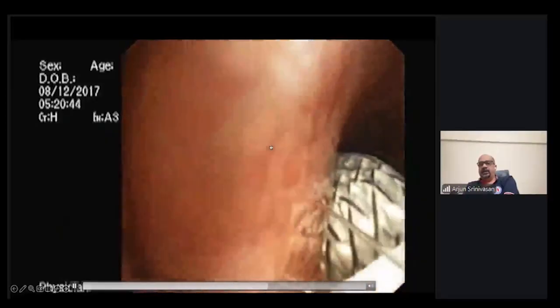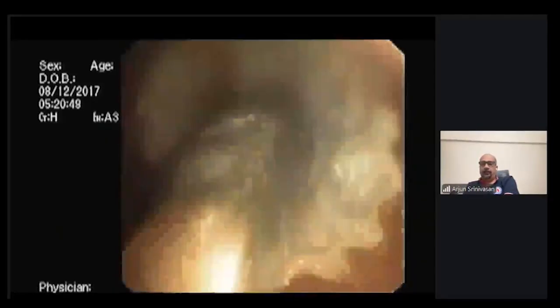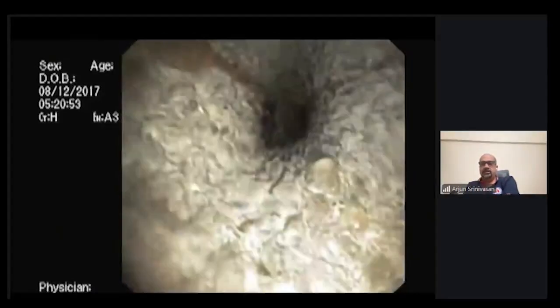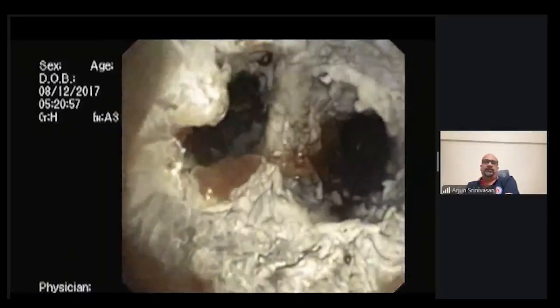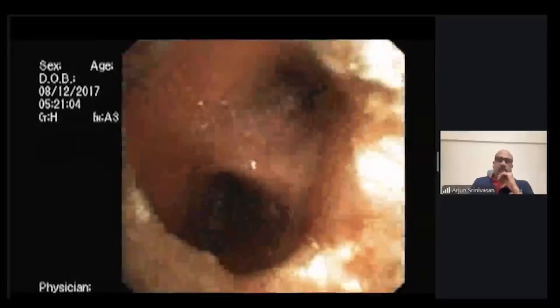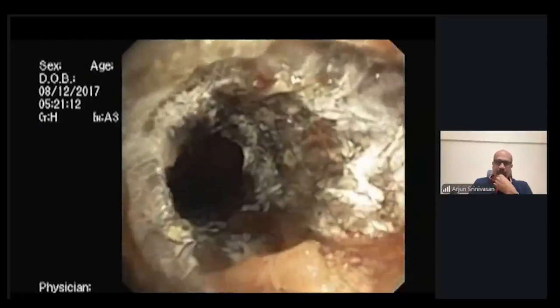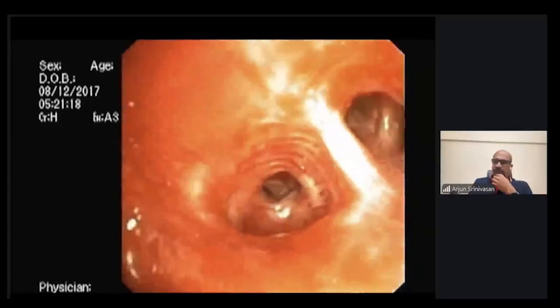And then the tracheal limb gets deployed. And you can see that the stent has been deployed perfectly, and only the left guide wire was used, and you can see it is sitting snug over the carina. The right upper lobe is visible, and when you look at the distal left main, it is well beyond where the tumor was. You can see that it has passed the tumor and the patient has achieved a sufficiently large lumen.